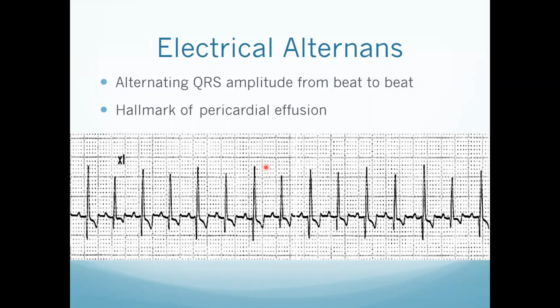So again, it's just another thing to have on your radar with these patients that present with hemodynamic compromise if you see this change on the ECG.